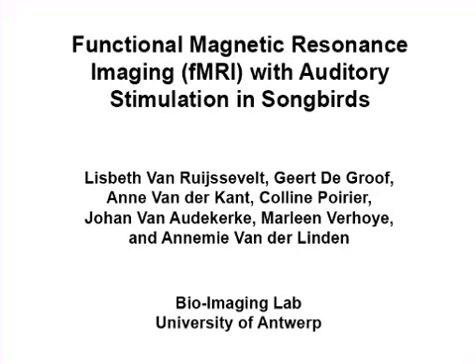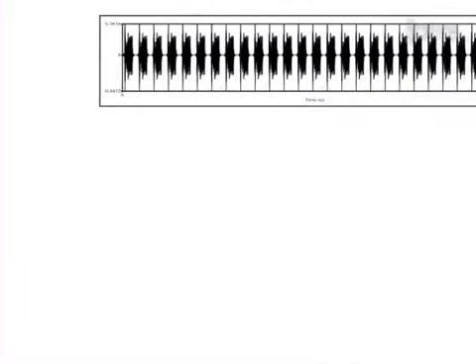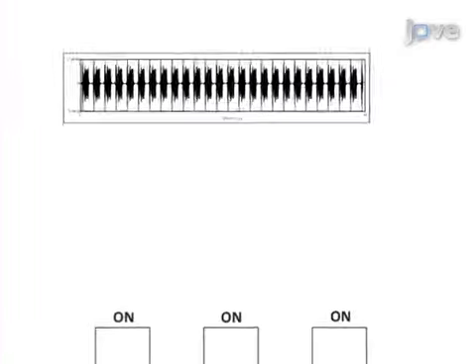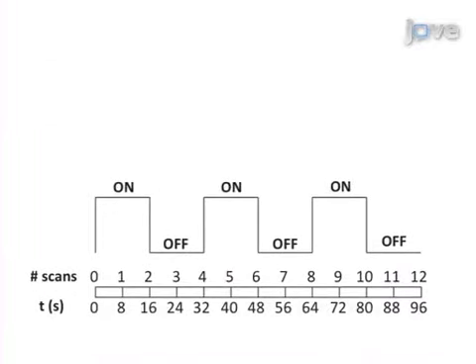The overall goal of this procedure is to demonstrate an optimized protocol for successful visualization of sound perception and processing in auditory and song control regions in the songbird brain using functional MRI. This is accomplished by first preparing good quality auditory stimuli, which can be incorporated into an on-off block paradigm to present to the bird during functional MRI or fMRI scanning.